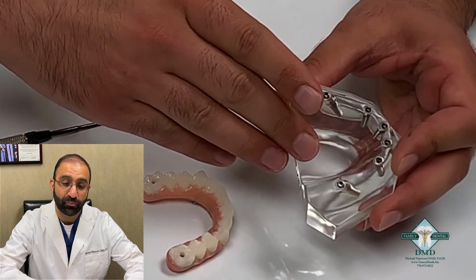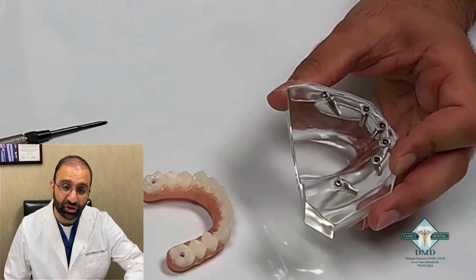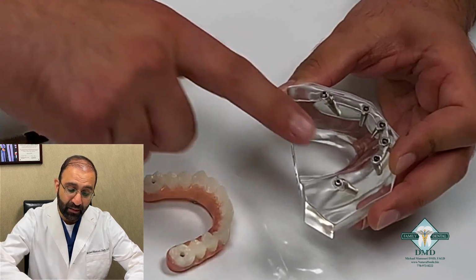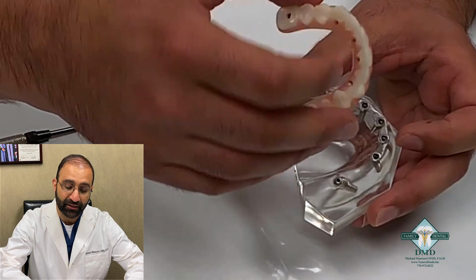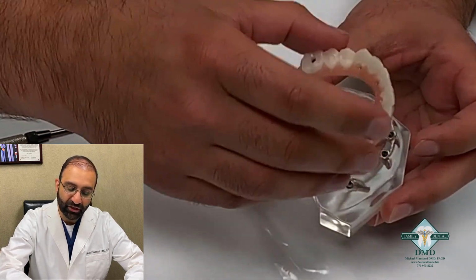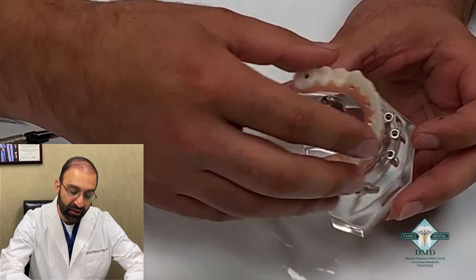So that will make the process much more comfortable. With the IV sedation, it's very safe, and our patients at least will be comforted during the procedure, so there won't be much discomfort. Once the implants are designed and placed into the jawbone, we've already made and fabricated a template for your teeth. The laboratory will be on site, so they will retrofit or already have made a set of teeth that will fit in those implants.